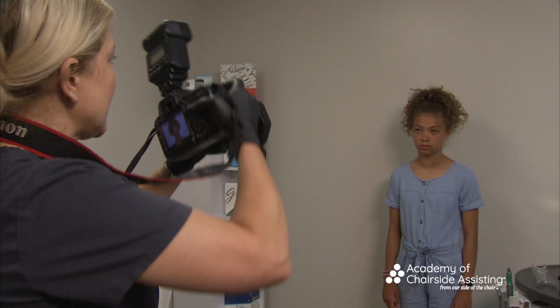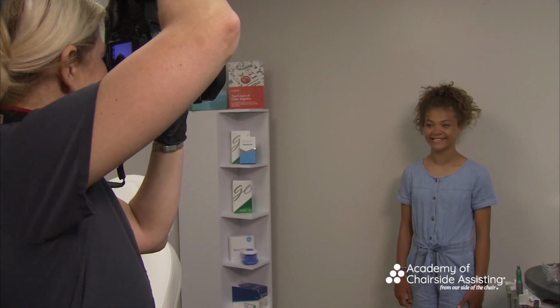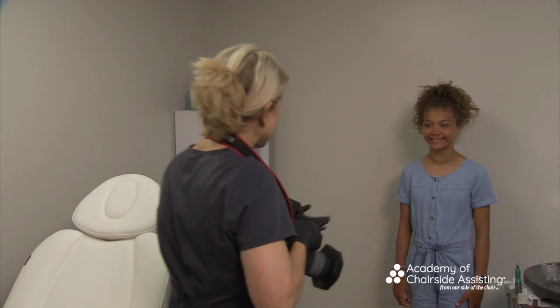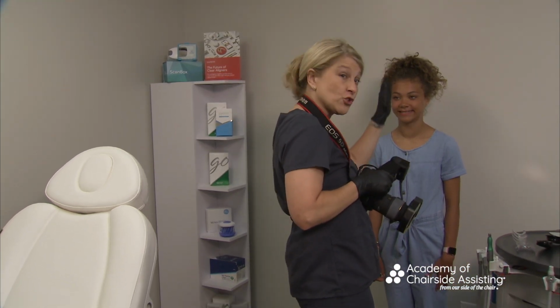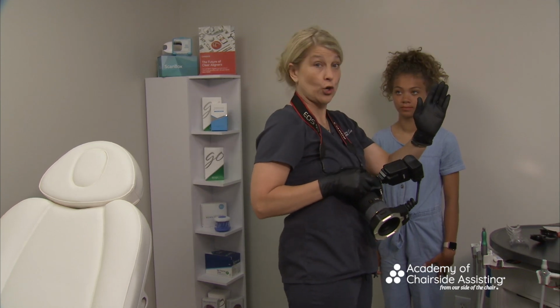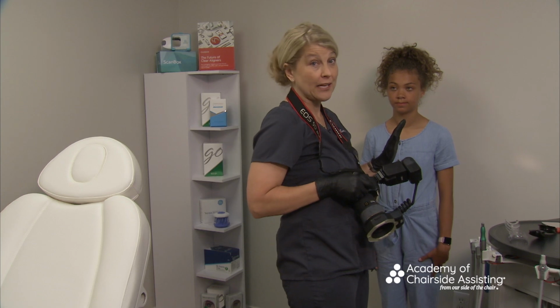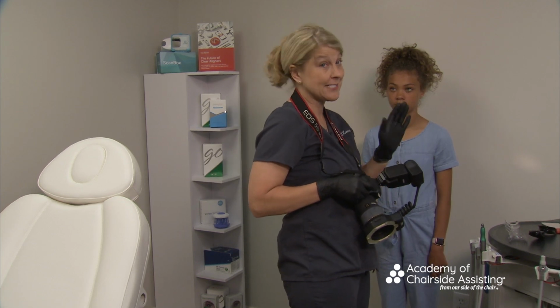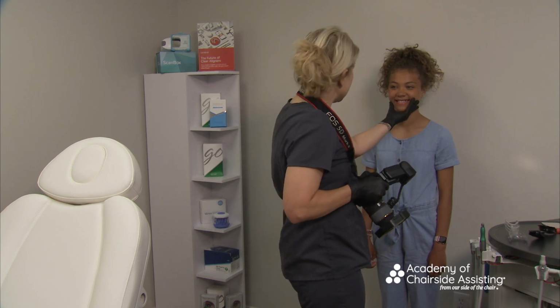So I'm going to take one of those, and I'm just going to change. I want you to give me a big smile. And again, Kylie likes to turn her head, which I'm glad because I can kind of troubleshoot it, okay? Nice and straight, because if the patient has an automatic, kind of curvature to the mouth or a little bit of a cant, I don't want to change that. I want the lab to be able to see this is where she is and it's exactly where her teeth fit in her face, right? So nice and straight, okay?